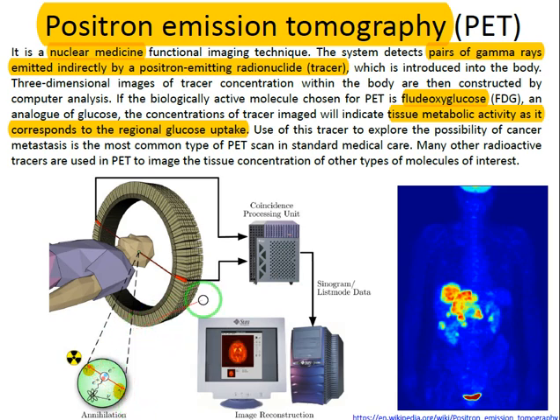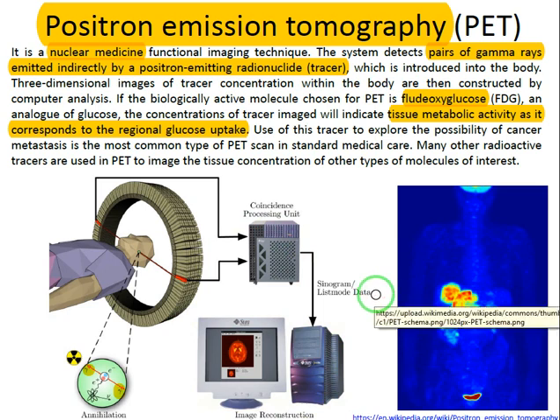They have high energy, and they have no penetration depth limit, so they will travel out until they reach the detector, and after that the image will be processed by the computer to get the three-dimensional image of our body.